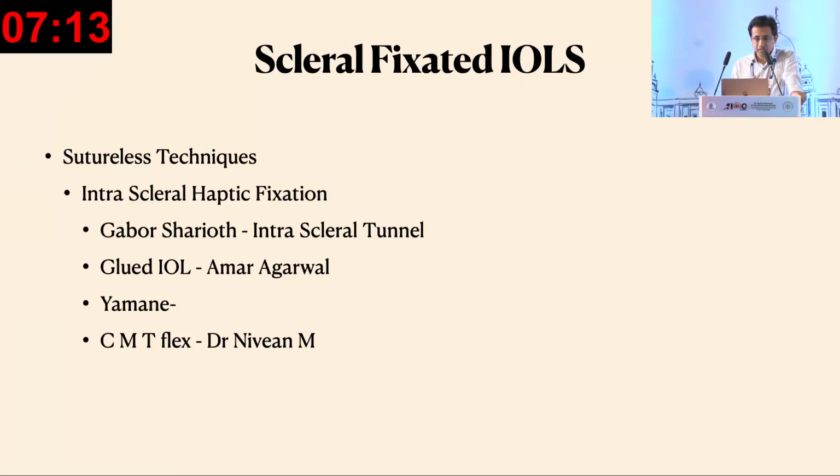And the latest technique, which is very popular currently, is the Yamane technique, wherein the haptic is cauterized to create a small bulb which goes and fixes into the sclera. And as we saw, Dr. Nevyas has devised a new wonderful device, the IOL called the T-Flex, where the T of the hydrophilic lens itself goes and holds or stabilizes the lens.